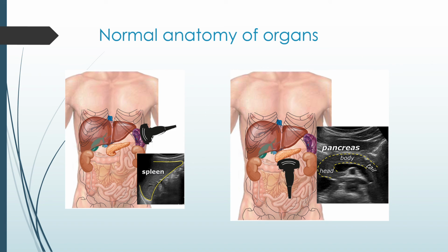And here on the left side you can see the spleen. The healthy spleen is homogeneous, and this shows the homogeneous reflection pattern, smooth contours, and craniocaudal length about 12 centimeters in adults. The echo reflection pattern is similar to that of the liver in most patients. The spleen may also act as an acoustic window for evaluation of the pancreatic tail.